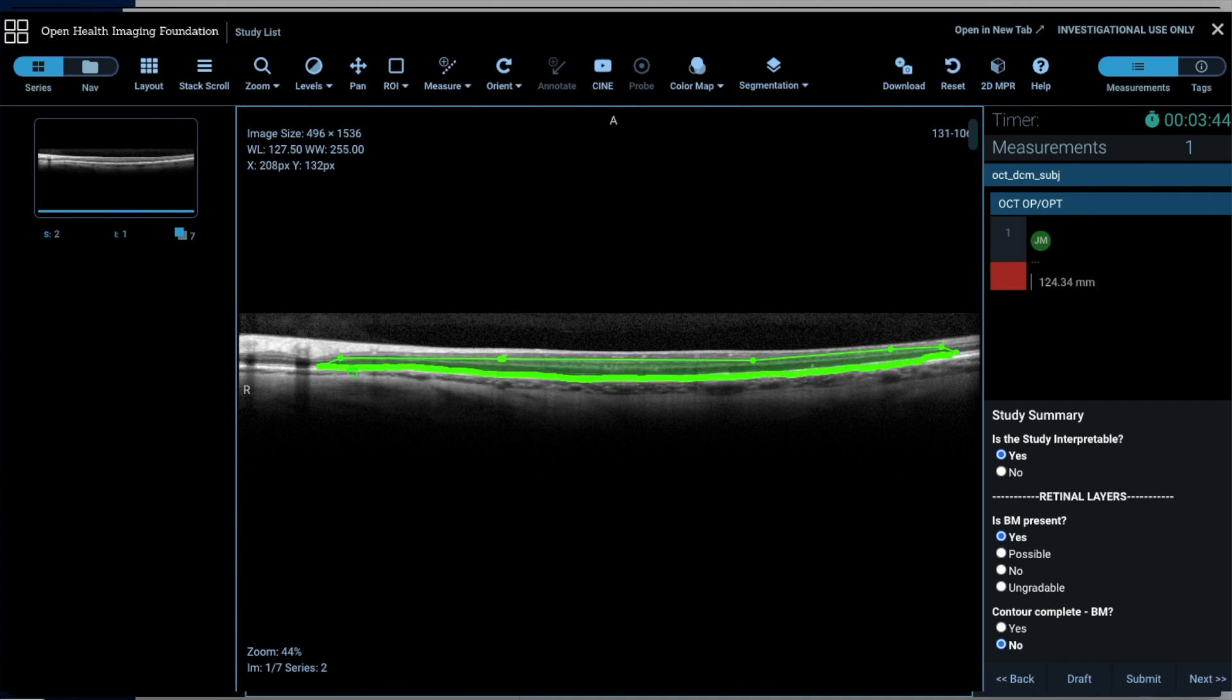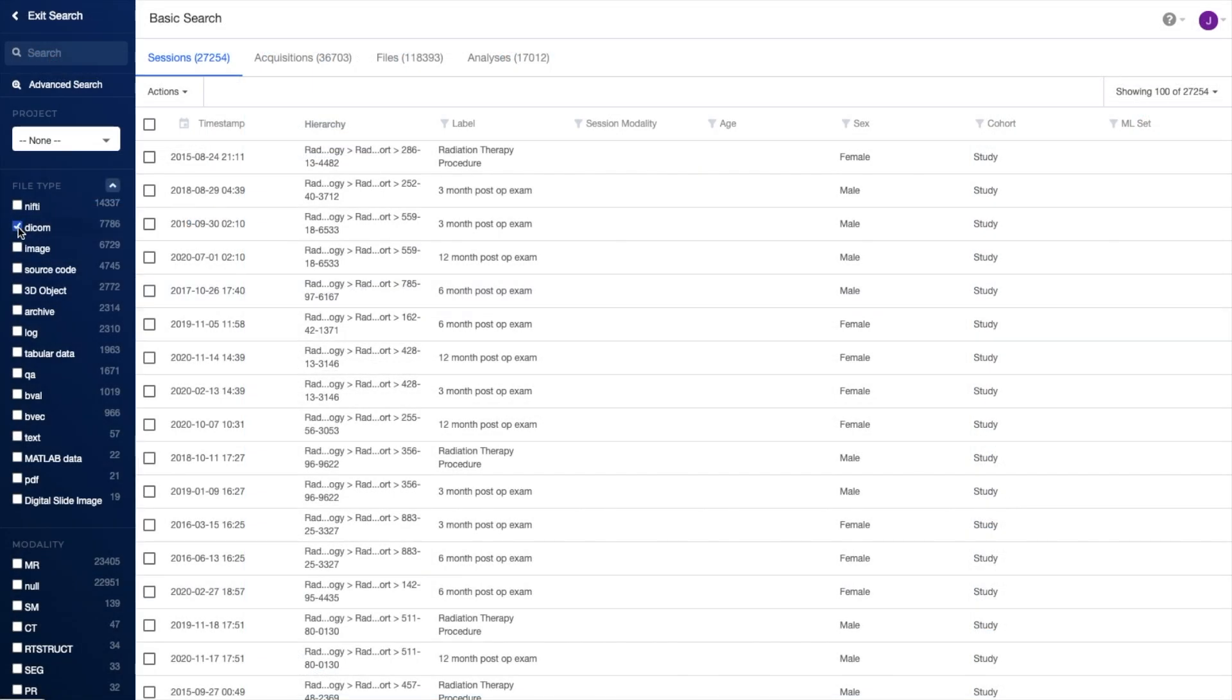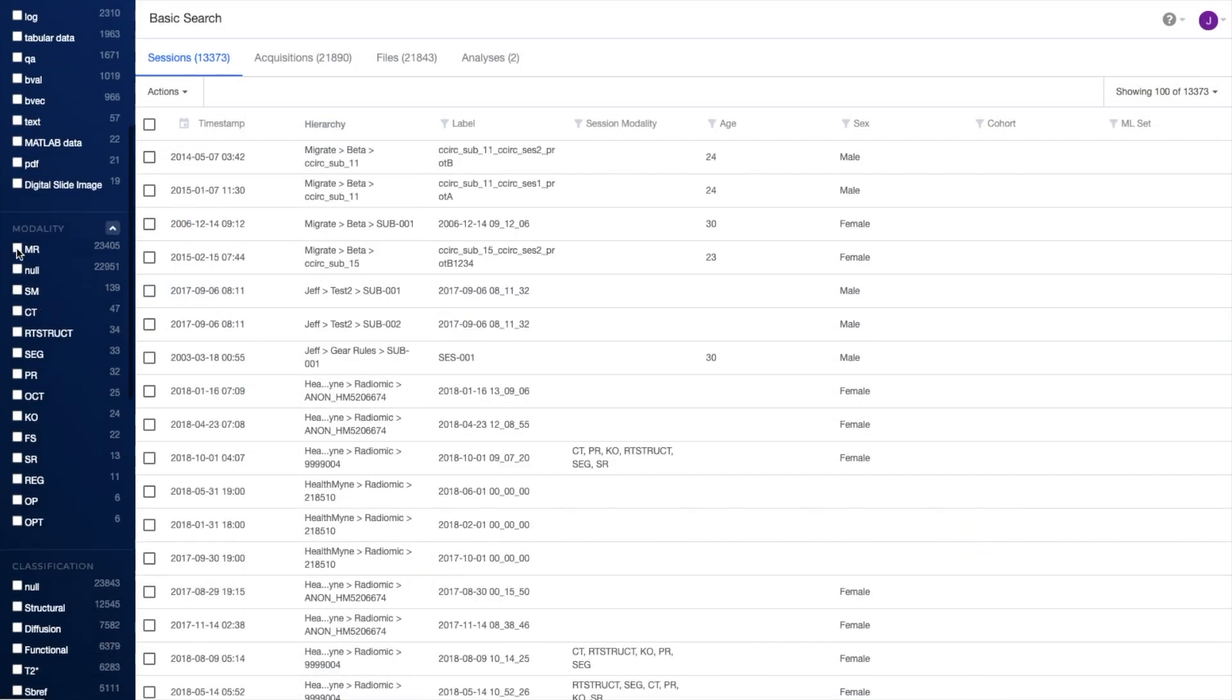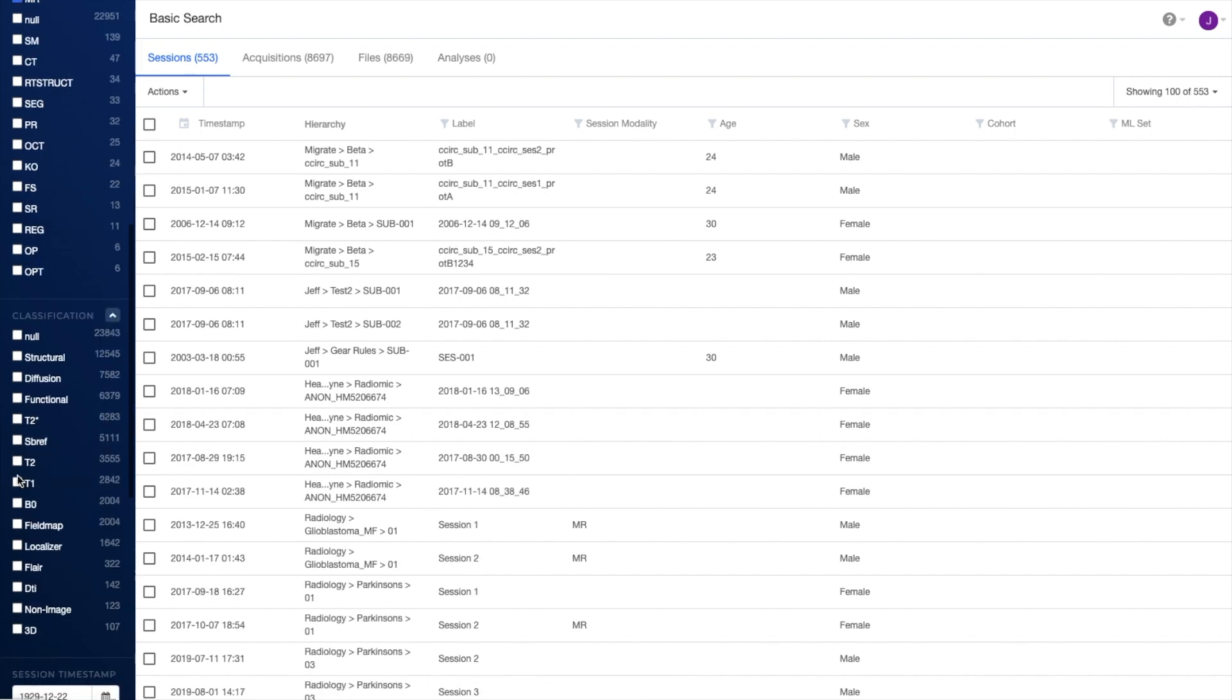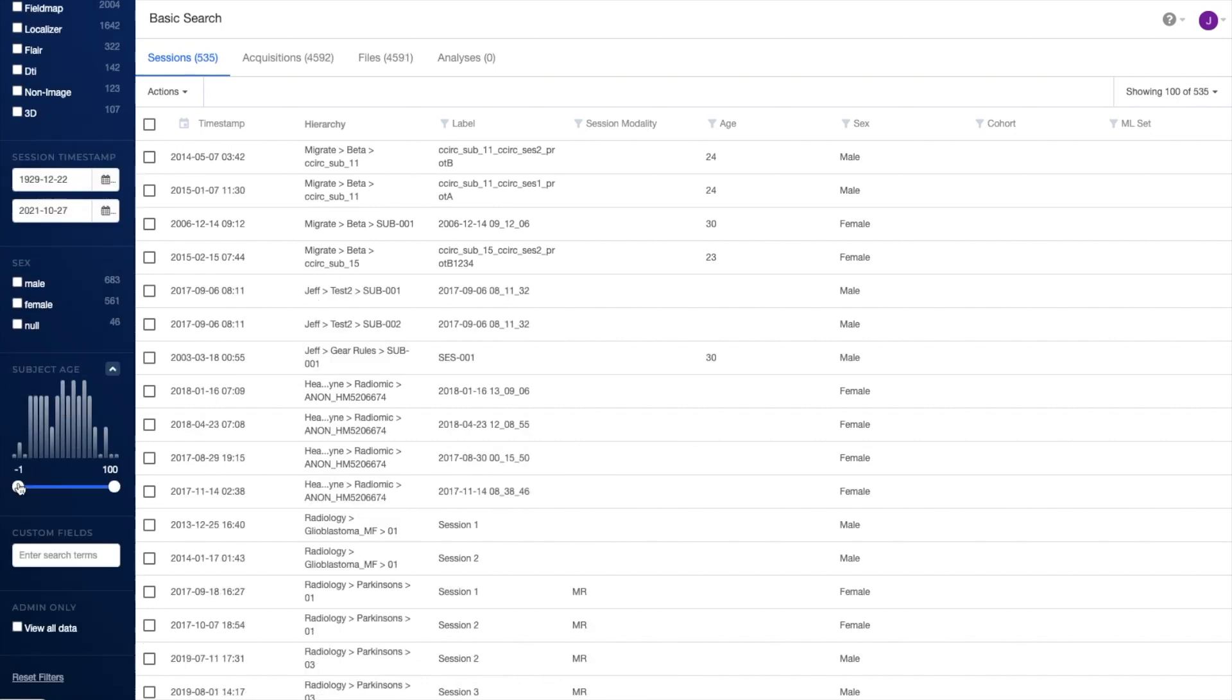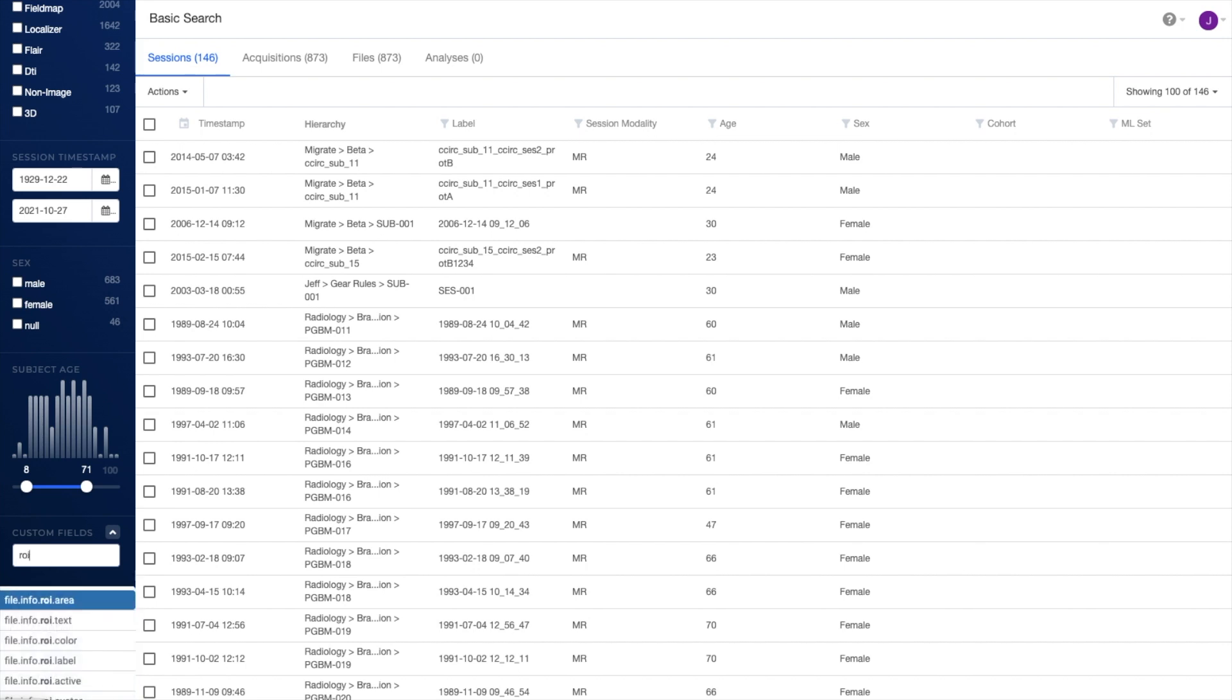These annotations and findings are stored as metadata, which, like all data in Flywheel, is indexed and searchable. With our fast and powerful search tools, you can quickly and easily curate potentially massive datasets by performing searches that key on both standard and custom metadata.